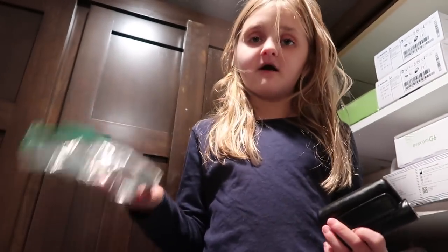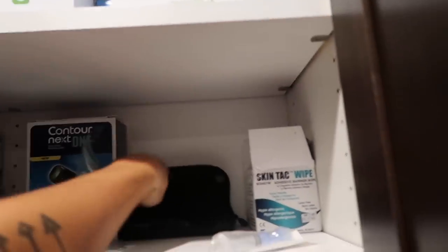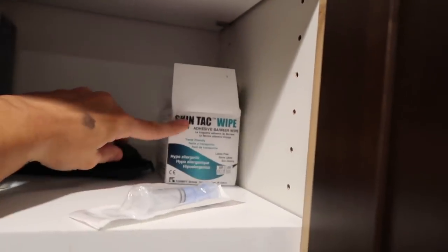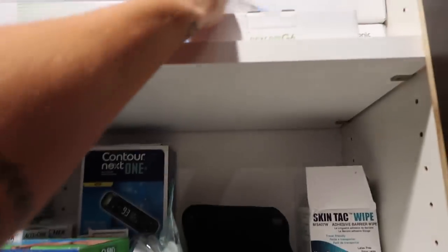You know why we hated this pump? Because the clip kept coming off every time and because it hurt. We have it just in case. And then she has this — this is her old bag with another meter in it that she would bring to school. Skin tack wipes.